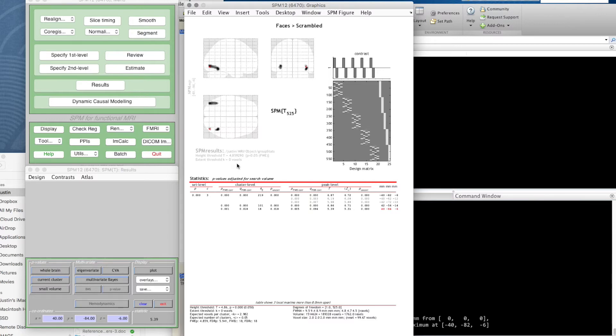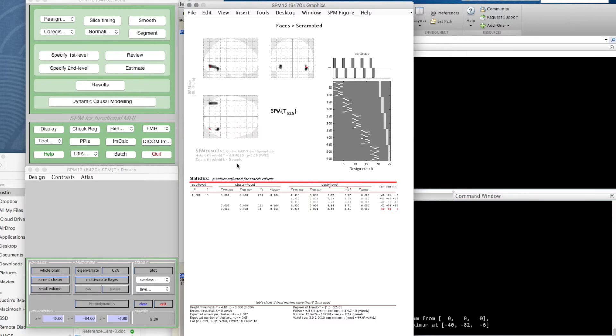This is extent threshold k equals zero voxels. You would normally leave this at zero because if you raise it, you're hiding data. If you've got quite messy data, an individual voxel that is apparently statistically significant is unlikely because adjacent voxels are so highly correlated.